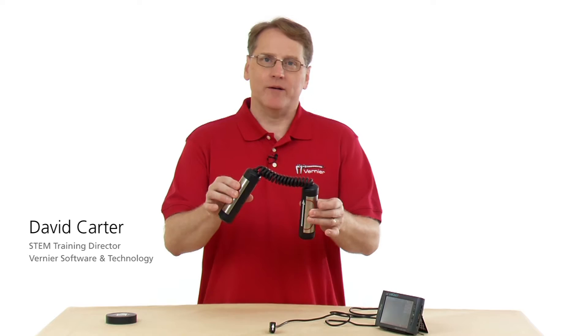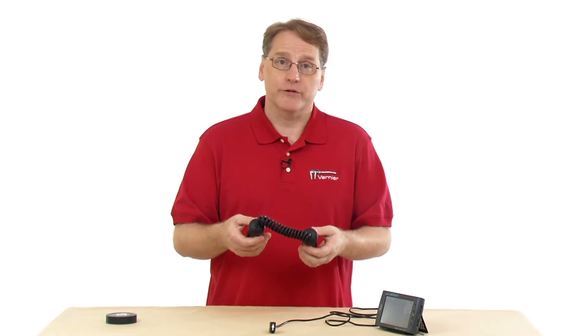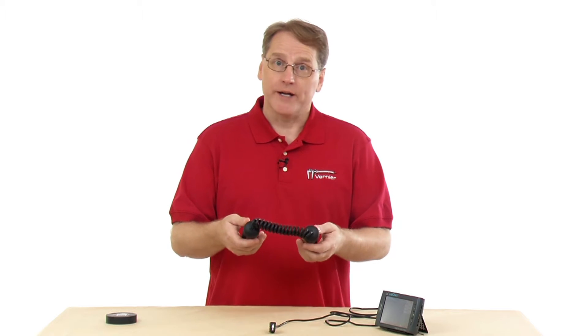This is the hand grip heart rate monitor. It's used to measure your heart rate — specifically in physiology and biology lab manuals that involve human exercise.